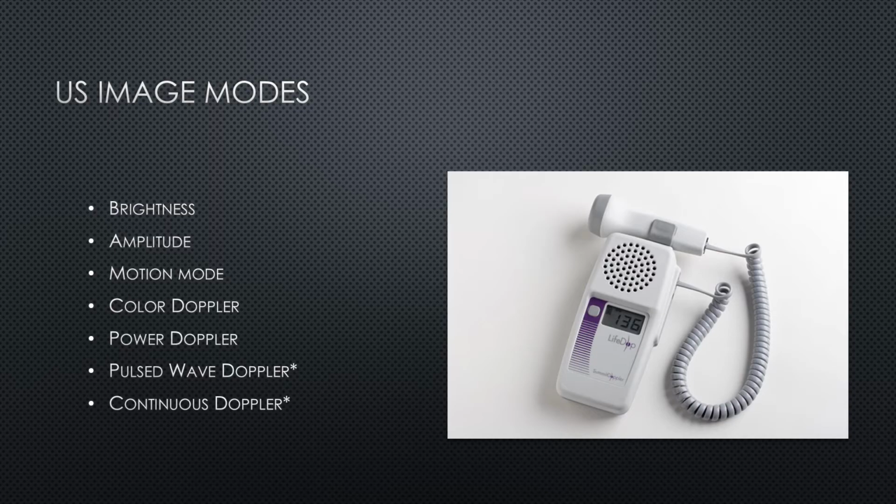And then I always caveat this lecture just saying that pulse wave Doppler and continuous Doppler I don't typically teach to residents because there's some complexity involved, and most of our point of care scans don't really require it. So my preference is, for any residents who might be listening, that you get really, really good at all of our core modalities before you try to move into the world of spectral Doppler.